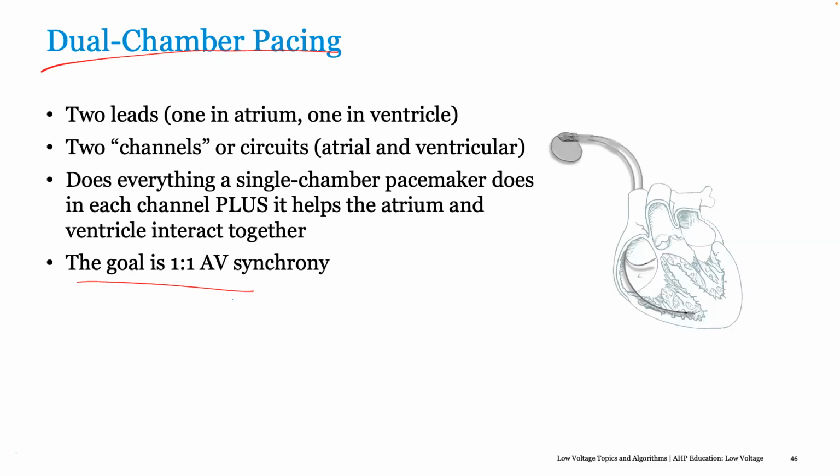Look, in my experience, with someone with chronic atrial fibrillation, an A lead doesn't bring anything to the party. You're better off just going in there, putting in your LV lead, your RV lead, and capping off the atrial port. Because even if you did put an atrial lead in, the device isn't going to use it. All it's going to do is mode switch to DDI anyway, which is a non-tracking mode, or you end up programming a VVI anyway.